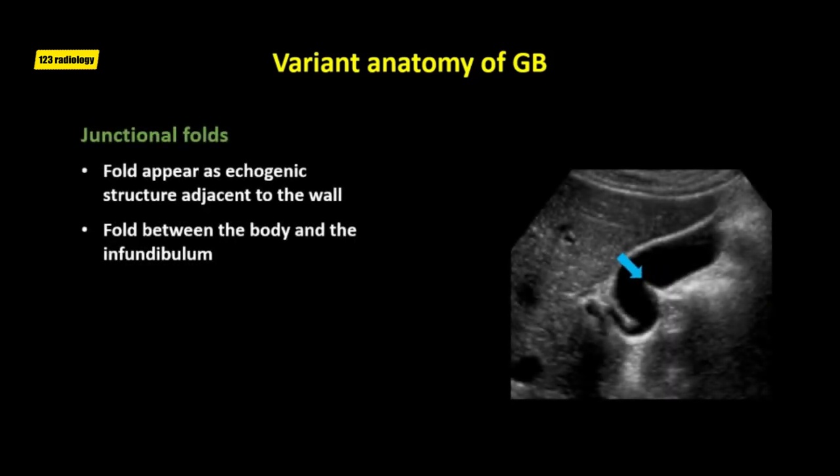Often many folds can be seen in the gallbladder neck. Folds are seen as echogenic structures adjacent to the gallbladder wall. The junctional fold is a fold between the body and the infundibulum of the gallbladder, and is a common anatomic variant seen on sonography. There are frequently one or more junctional folds in the gallbladder neck, and occasionally folds are seen throughout the gallbladder.